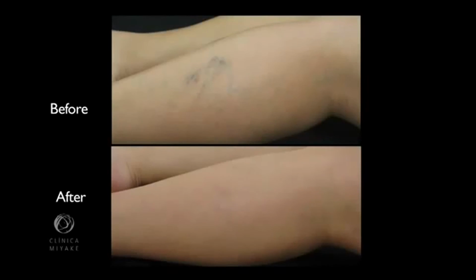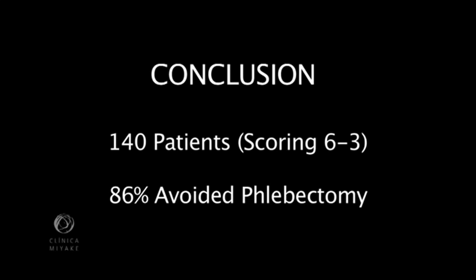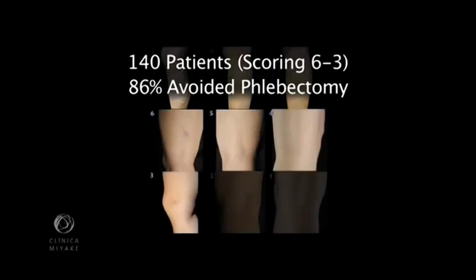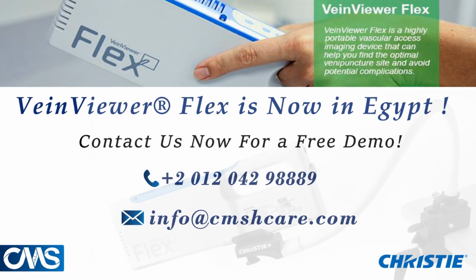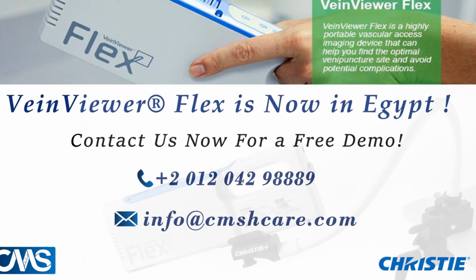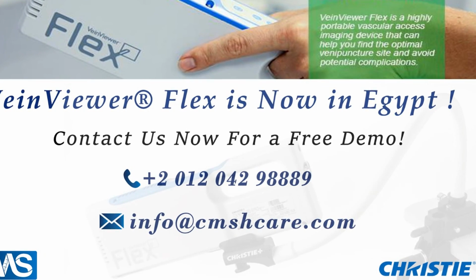Conclusion: using CLACS guided by the VeinViewer, we were able to avoid phlebectomies, formerly our first choice for patients scoring 6, in 86% of 140 patients scoring 6 to 3 on the table you've seen. And more importantly, avoiding complications like skin ulcers, anaphylaxis, and embolism. The VeinViewer exposed feeder veins in such a way that gave us a new perspective and comprehension of leg veins.